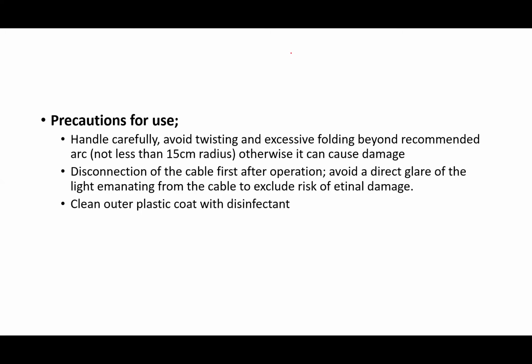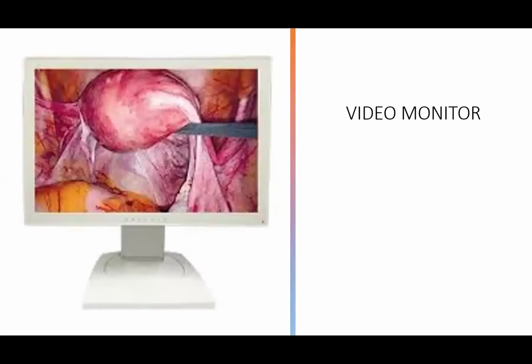Okay, you clean the outer plastic coat with disinfectant before use. Now, the next viewing imaging device is the video monitor. The video monitor is the screen on which we see the image that is picked up by the camera, okay?